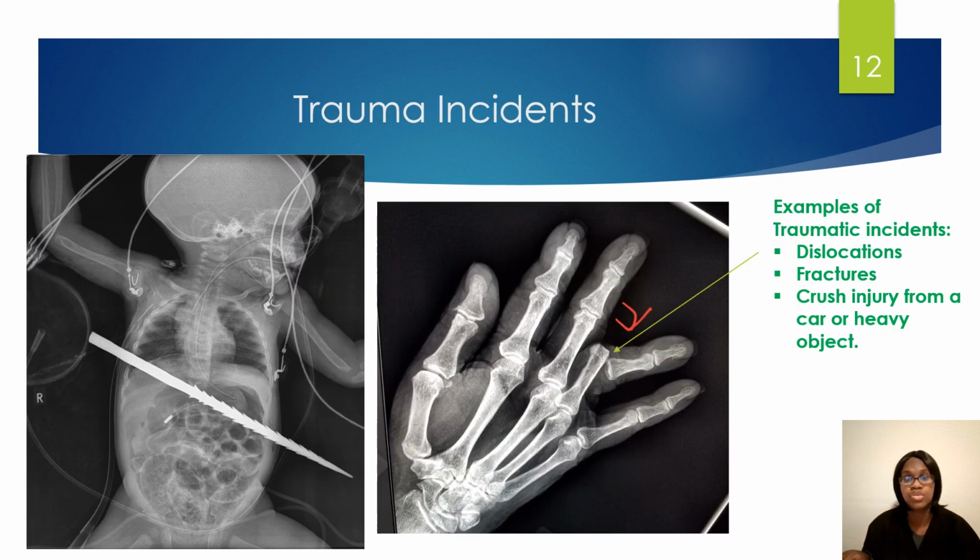And then you have your trauma incidents. You see like different fractures right here. You see something going through this baby's abdomen. And even if this is just like examples of what a trauma incident would be.